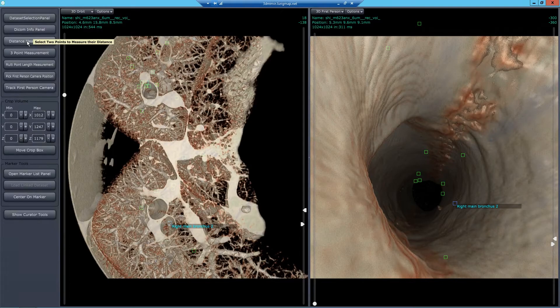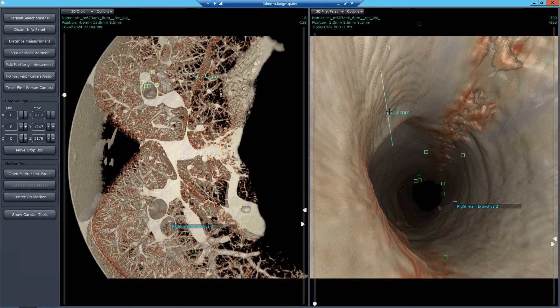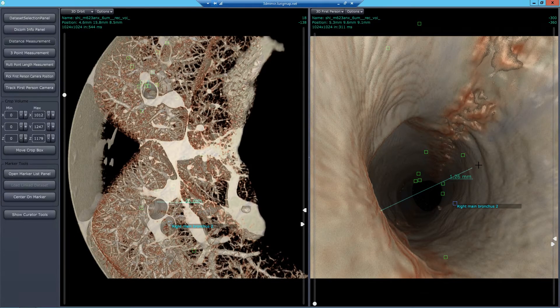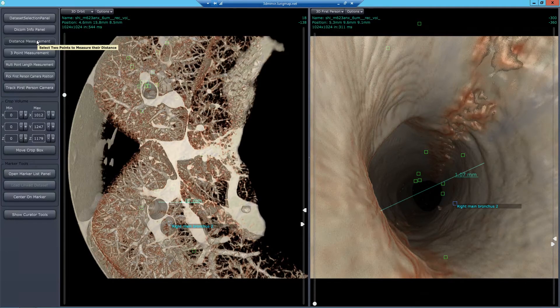We have measurement tools — there are several of them. This one is a two-point measurement tool. We click on a spot, we click on the next spot, and there's a measurement. We can take these measurements in either window, but the measurement shows up in both windows as if the data set or the lung were transparent. This is a very useful tool, especially when we're looking at small spaces and want a good estimate of the size. The tool is active as long as the button is clicked — it's dark gray. We turn it off and the measurements go away.